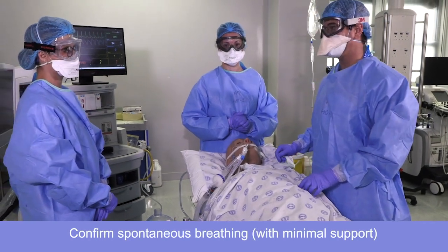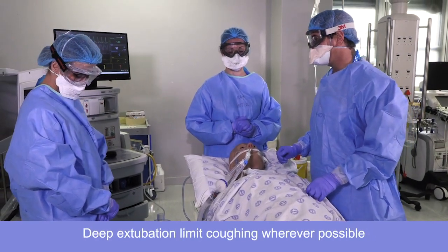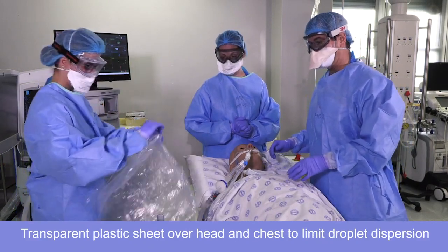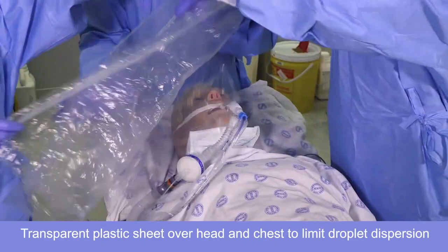We've reached the end of the case. We're going to extubate the patient deep if we can. We're going to try and limit coughing. Let's put a plastic sheet over the patient's head and neck to avoid droplet dispersal.